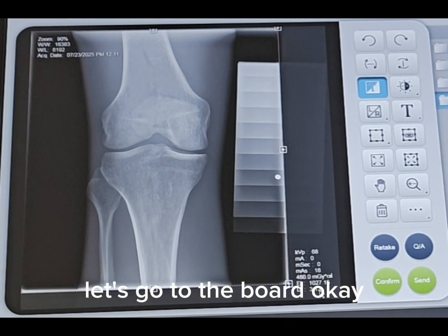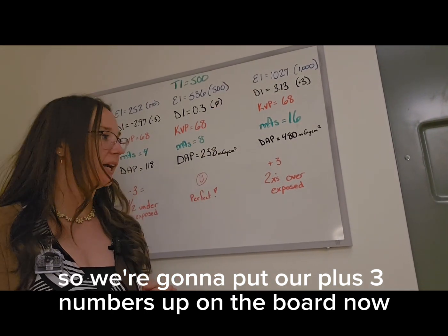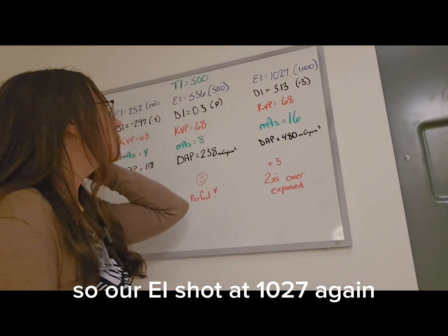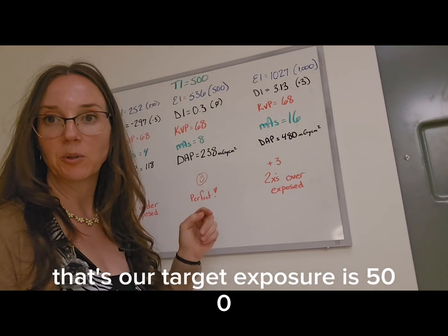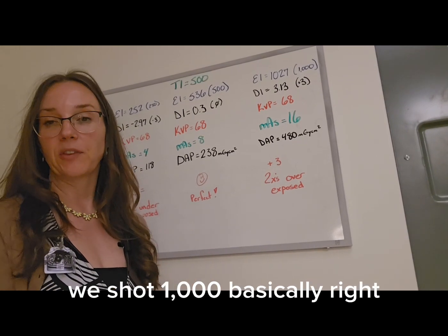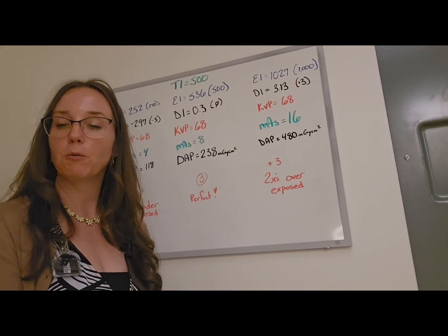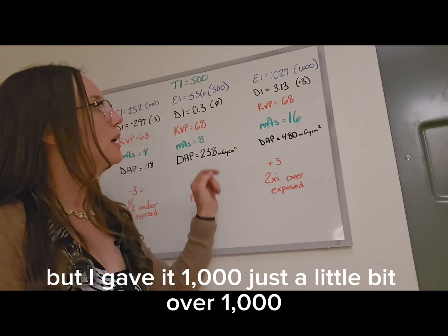Let's go to the board. Okay, so we're going to put our +3 numbers up on the board now. So our EI shot at 1027. Again, we were looking for an EI of 500. That's our target exposure is 500. We shot 1,000 basically, right? Which means that I am 2 times overexposed. The computer was looking for 500, but I gave it 1,000. Just a little bit over 1,000.